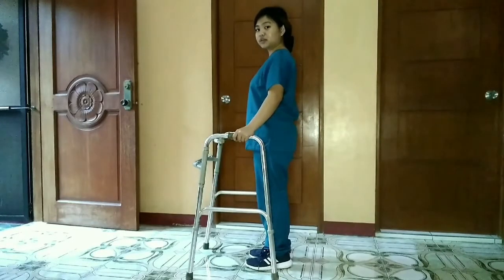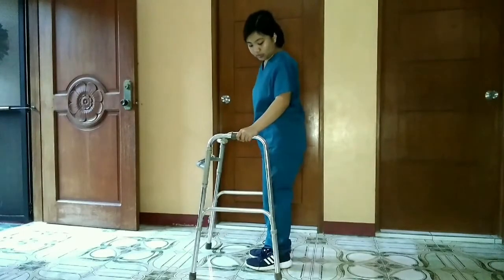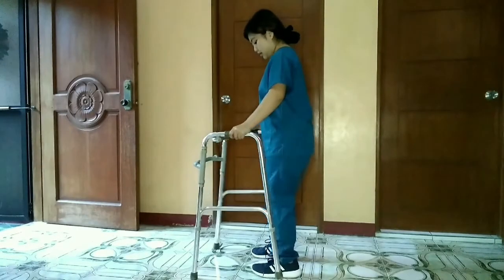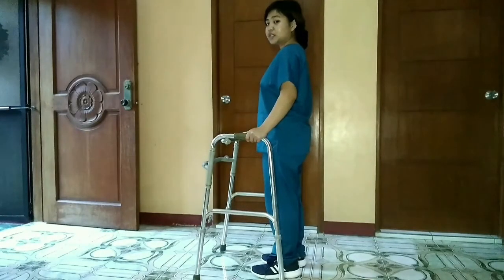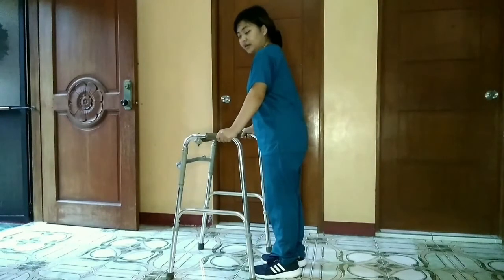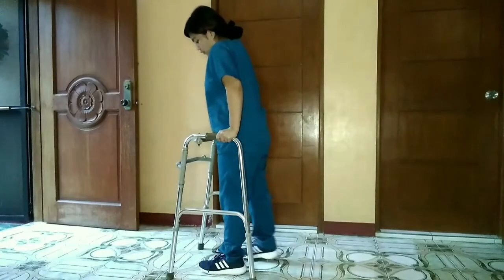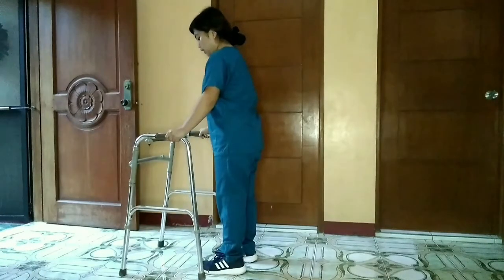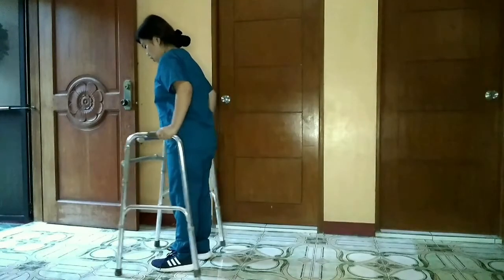And then for the position of the feet, make sure the back tips of the walker are matched to the middle of the patient's foot. The next thing that the patient must do is to move the walker forward and then move the weak foot forward, followed by the strong foot. Okay, 1, 2, 3, go. Move the walker, move the weak foot, followed by the strong foot. Move.